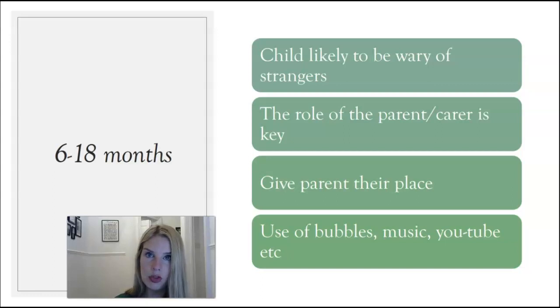I don't know if it's because people are rushing to get through, or people are so experienced in paediatric radiography, they think that they know better. And they might know better technically, obviously, but they don't know what's best for that child. The parent or the carer knows what's best for that child. So I think it's really important to make sure that you're asking the parent, well, how do you think they like to be held, or what do you think would help soothe them? It could be that you use bubbles. Sometimes we put on music. Sometimes we just get out the iPhone and put on Peppa Pig and let them look at the colours and the noises. All of those things really help to soothe a young child if you're having to x-ray, depending on what part of the body you're x-raying.